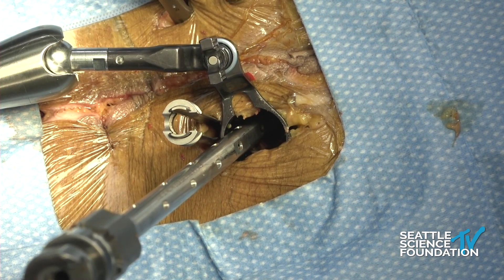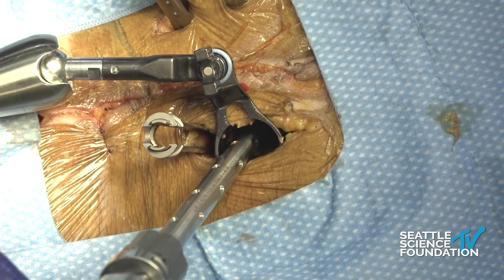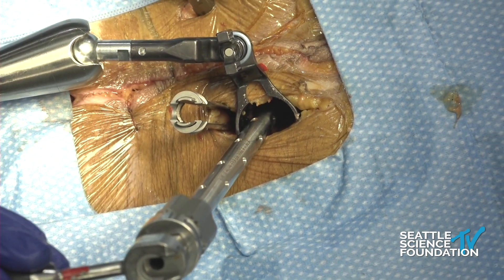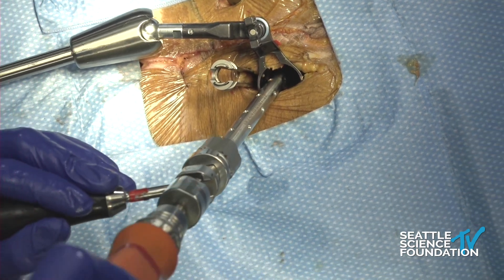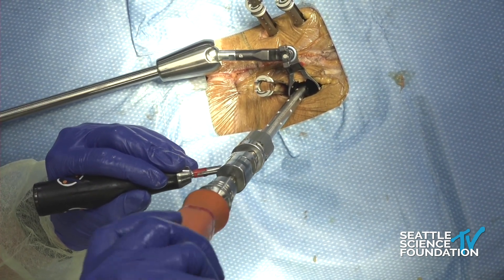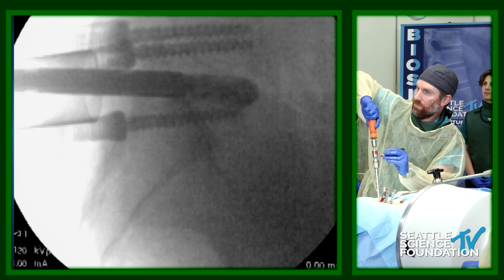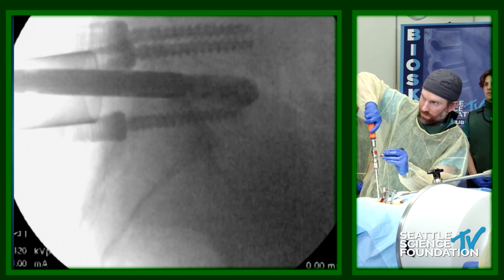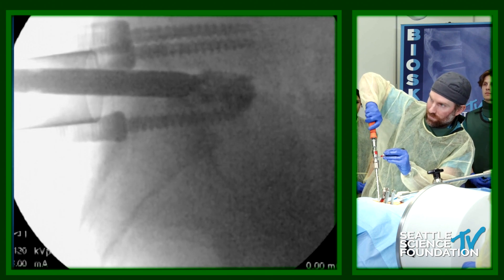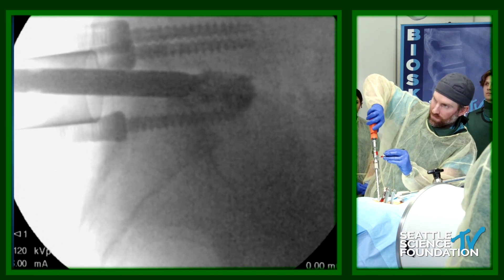Now we're putting in one of the nice expandables. Tyler's going to go ahead and load it up. We're putting in a unilateral expandable and then we'll dial it up. Doing this minimally invasively is interesting — they actually hurt more after surgery because you're going through the muscle and not midline. So even though it's minimally invasive, they do have more pain. But on the flip side, I think the exposure, blood loss, and infection tend to be less. This is the little expandable that he's putting in.